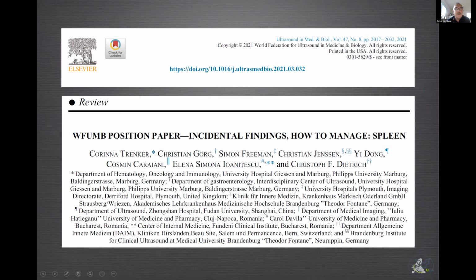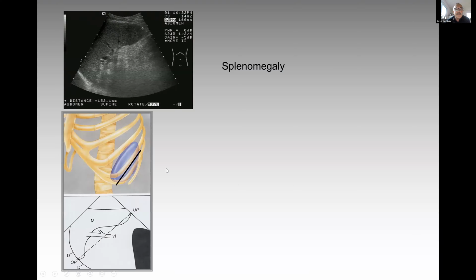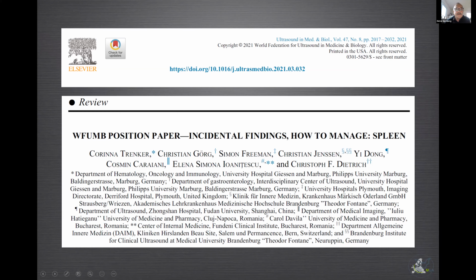It is published in 2021, a position paper of the WFUMB about how to manage spleen incidental findings. For me, important was that we can find incidental findings nearly in 1 to 3% of all of our patients. And they give in their paper a lot of information about the literature. It's a classical review of those authors.